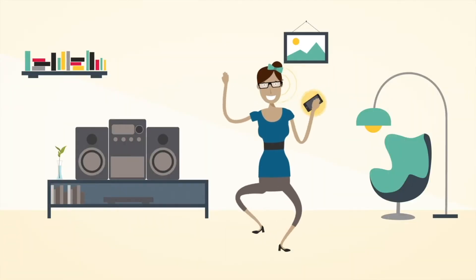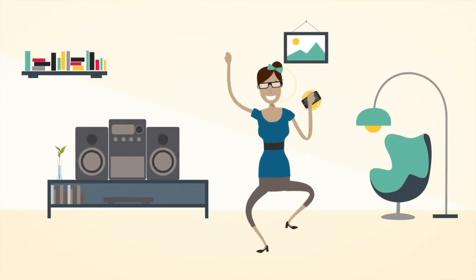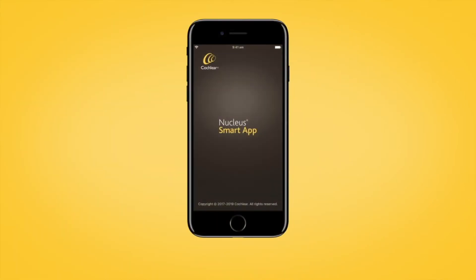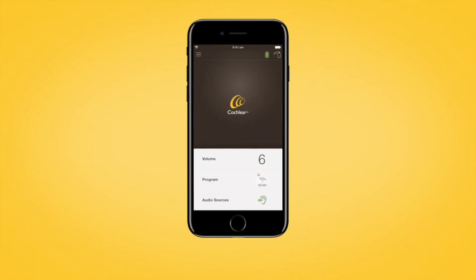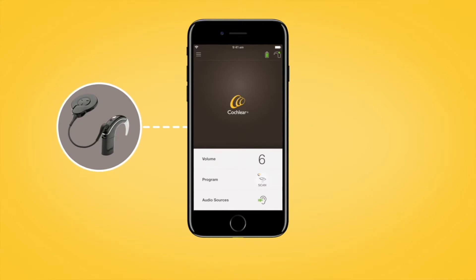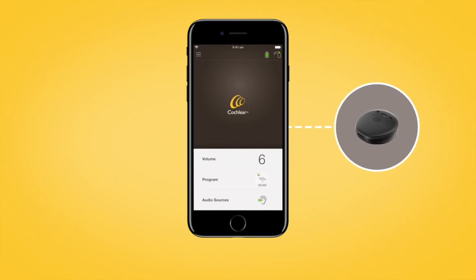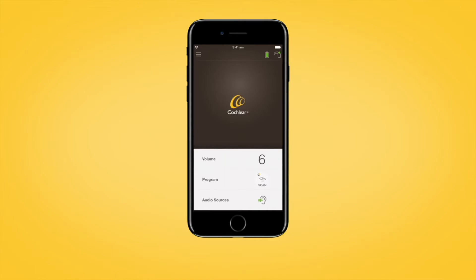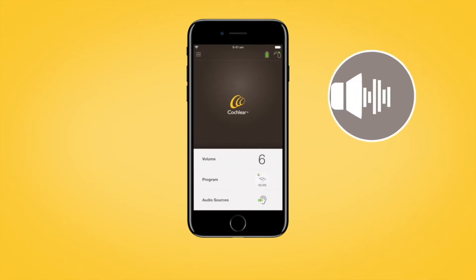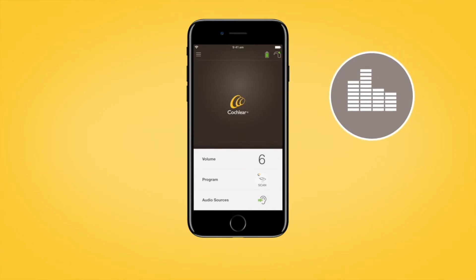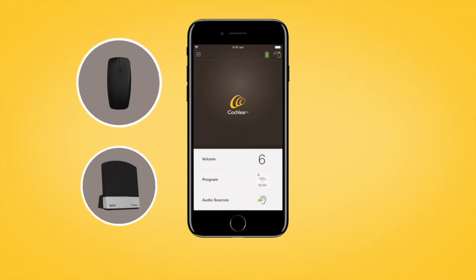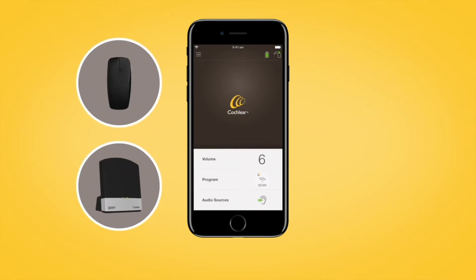When paired with a compatible Apple or Android device, you can use the Cochlear Nucleus Smart App to control and monitor your Cochlear Nucleus 7 or Canso 2 sound processor. You can quickly and easily adjust your sound processor volume, change program, and start and stop streaming audio from true wireless devices.